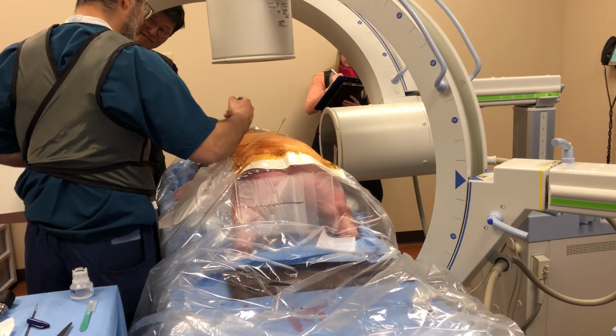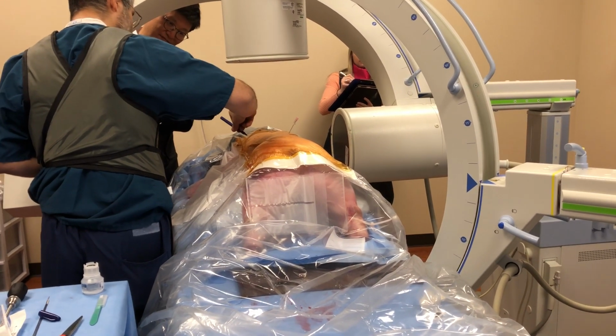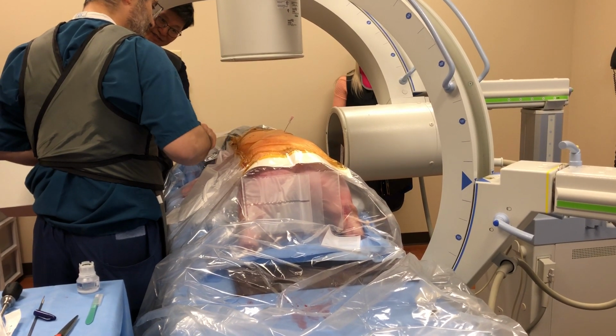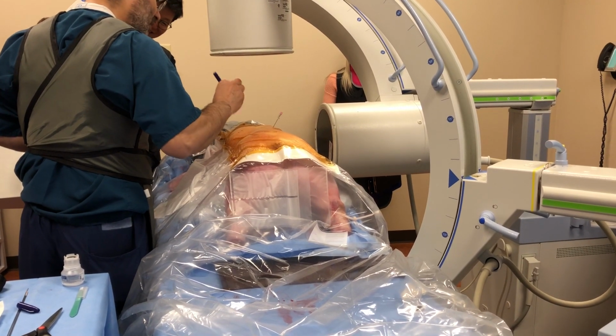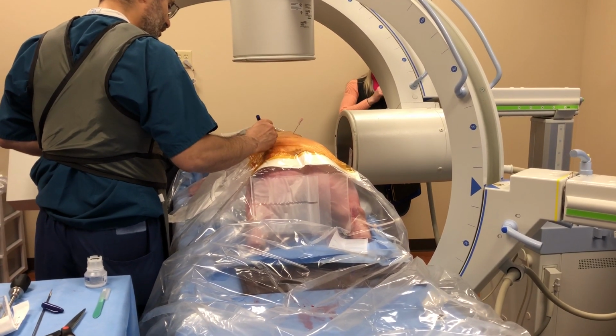Additionally, there is another consideration. You don't go in the plane. You go way superior. Imagine this is the iliac crest. L5S1 is somewhere here, right? So you do all the considerations that you do for the other levels, but here you have two lines.